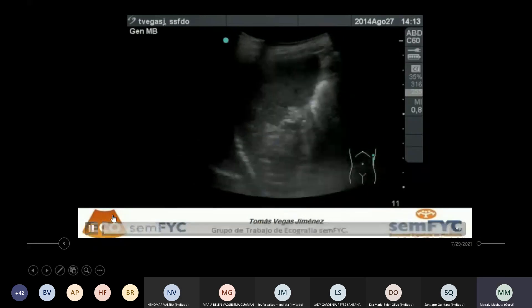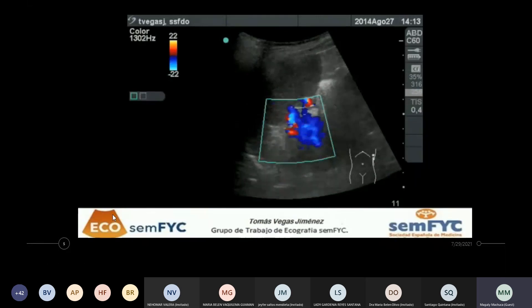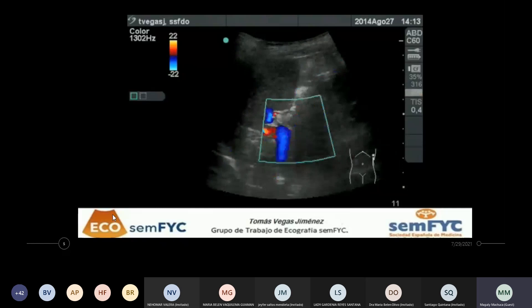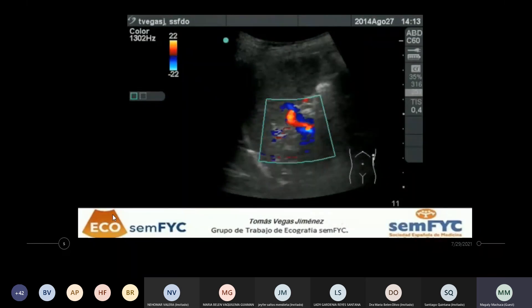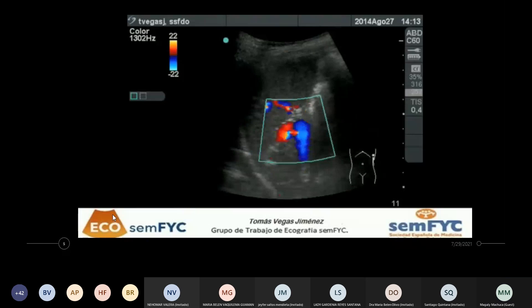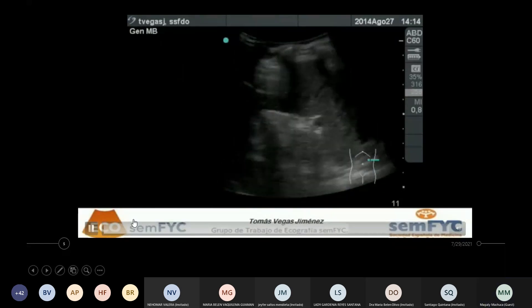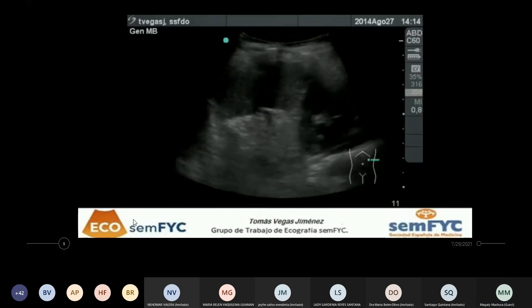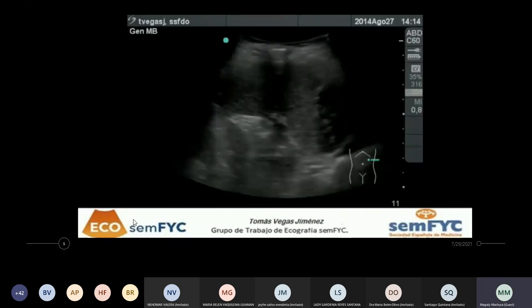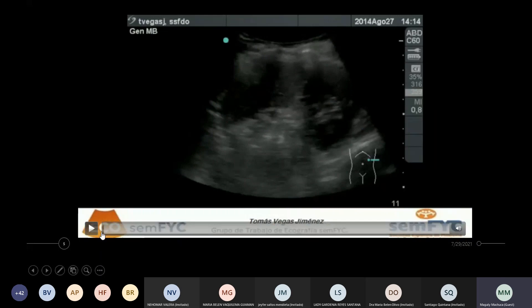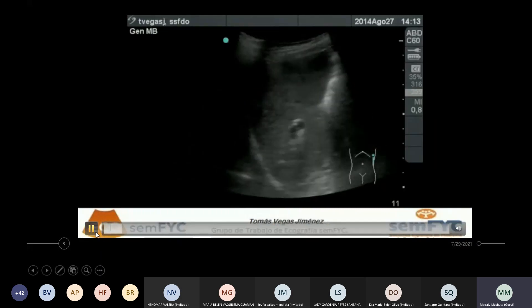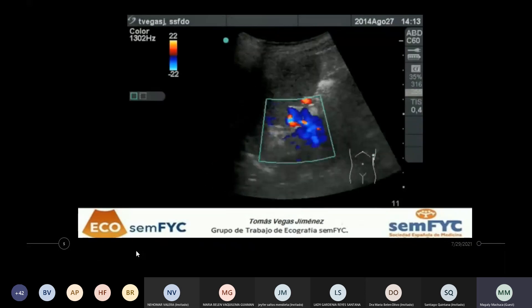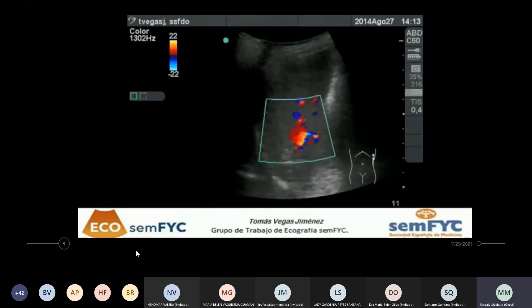Para que vayan viendo cómo se ve, cómo son las ecogenicidades. Aquí le ponemos el Doppler color y podemos ver también la arteria y la vena esplénica, el hilio esplénico. También tiene relación con el estómago. A veces vemos una imagen que está adyacente al vaso y suele ser el estómago que está distendido con líquido, entonces suele verse al lado del vaso una imagen así.